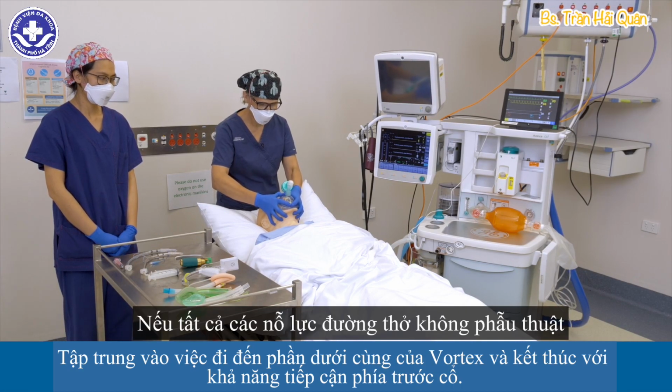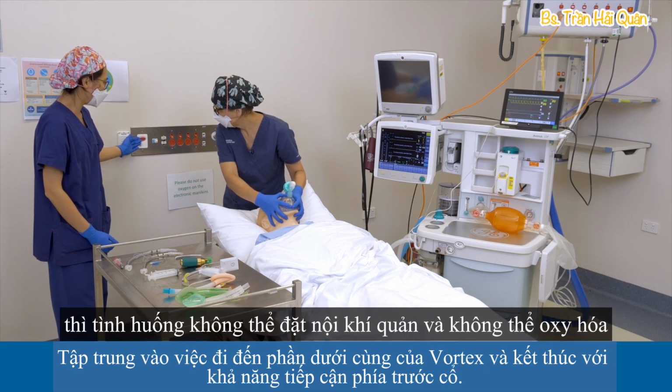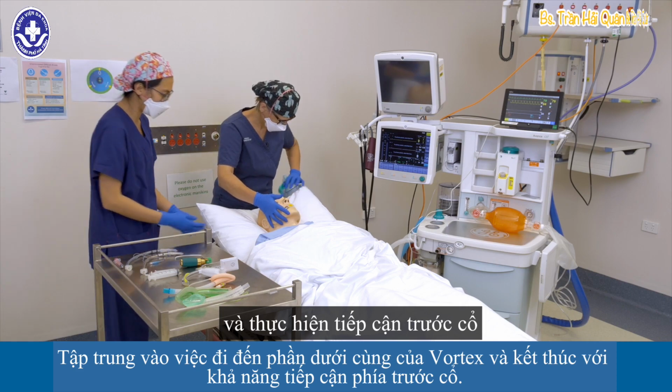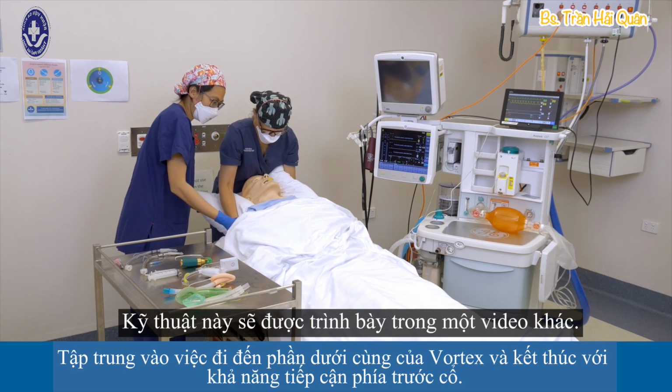Should all non-surgical airway attempts not achieve safe oxygenation, a can't intubate and can't oxygenate situation needs to be declared and front of neck access performed in order to achieve oxygenation. This technique will be covered in another video.